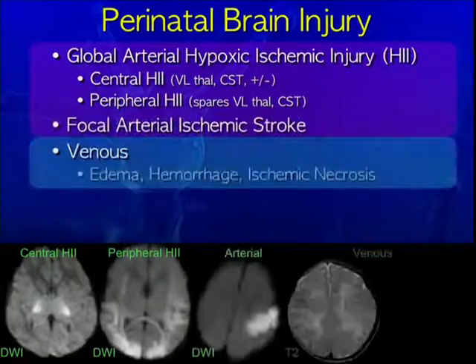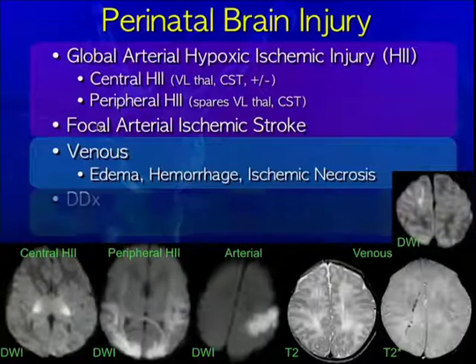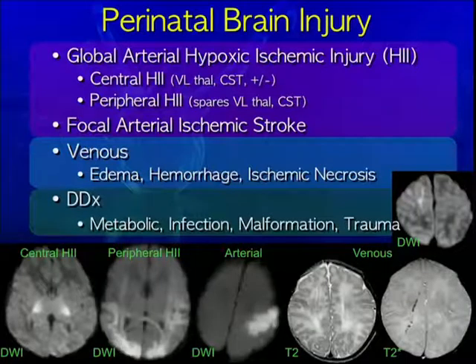We started out with a pattern-based approach to imaging. Think about differential diagnosis. Think of all the imaging we have at hand. I totally agree with Dan's comments about prenatal imaging. We're also working very hard in that area and have recently gotten funding to develop sequences to do flow and other metrics with placenta and fetus.